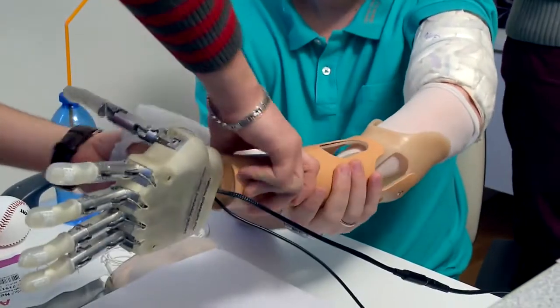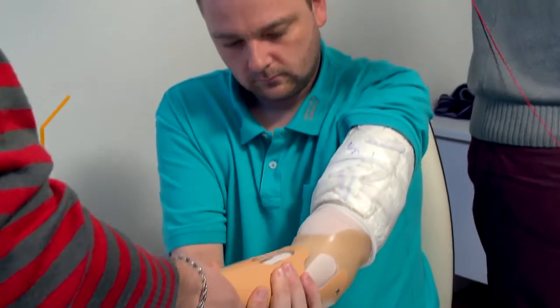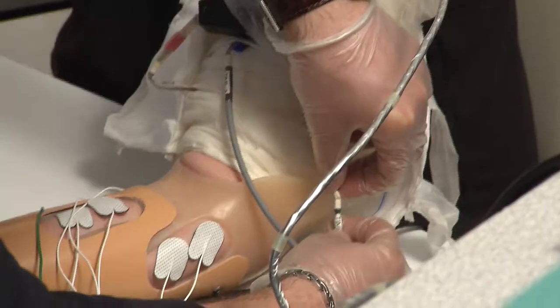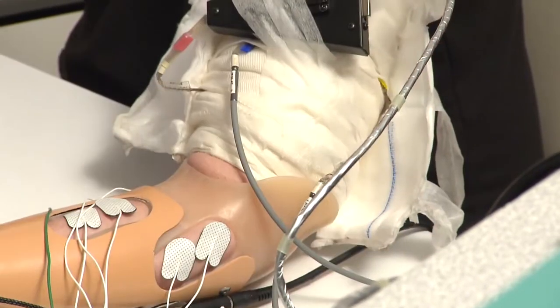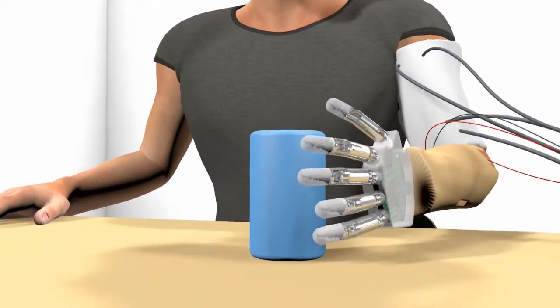The participant is provided with myoelectric control over several different hand movements. Muscle signals are decoded in real-time and motor commands are immediately transmitted to the robotic hand.